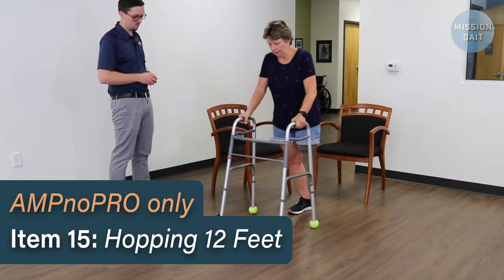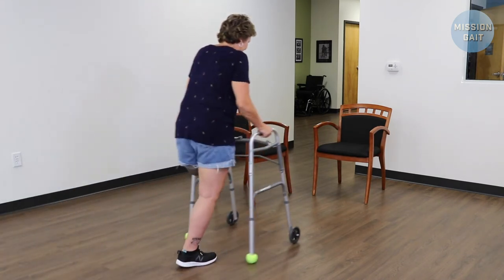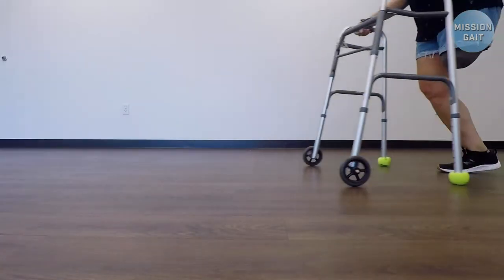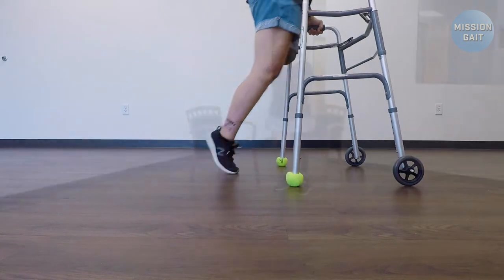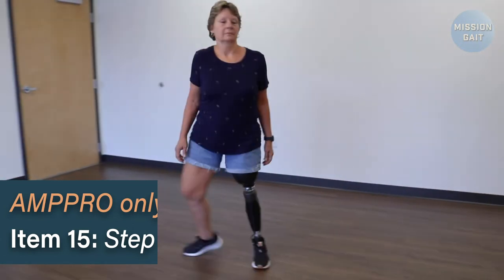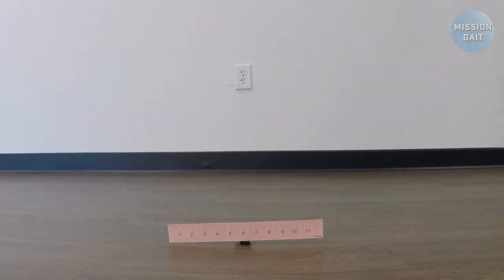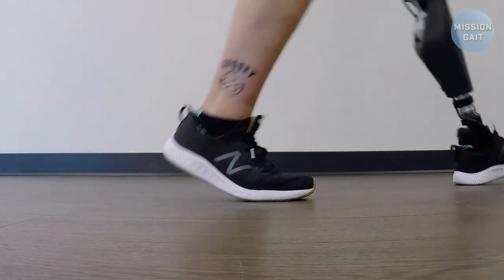For the AMP No Pro, item 15, hopping 12 feet. As the patient begins hopping, assess the patient's hop length, looking to achieve at least a 12-inch hop. Secondly, assess the patient for clearing of the foot. Score for both hop length and foot clearance. For the AMP Pro, item 15, step length and height. As the patient begins walking, assess step length, looking for the swing limb to advance 12 inches, and assess for clearing of the foot. Score for both step length and height for each limb.